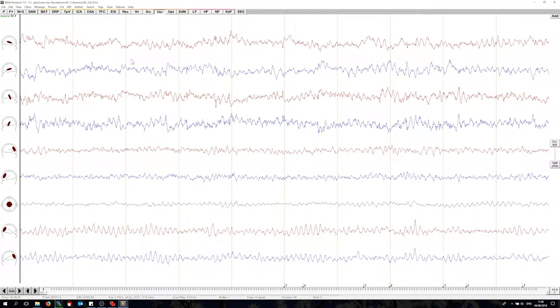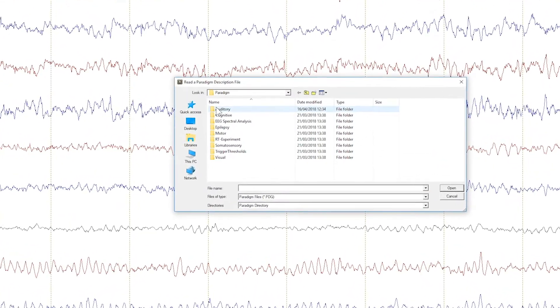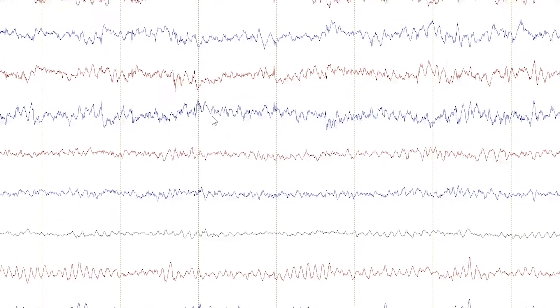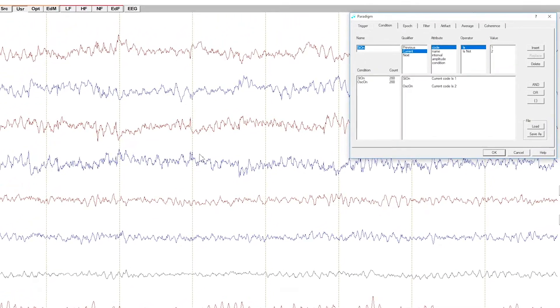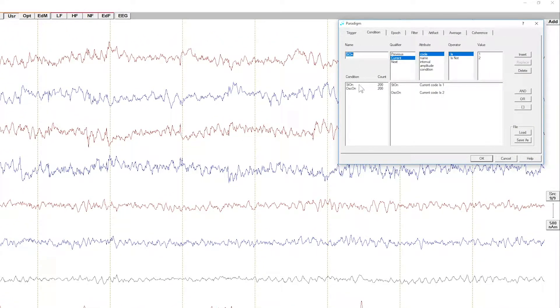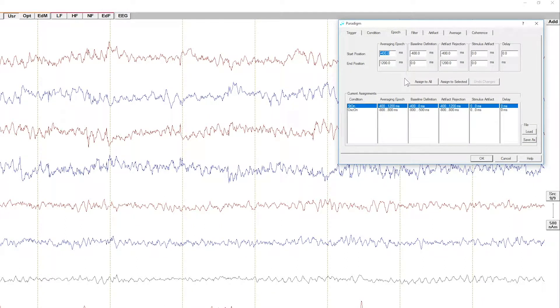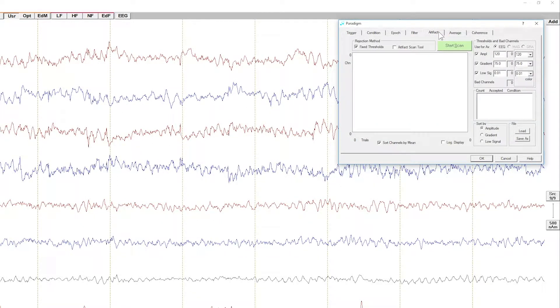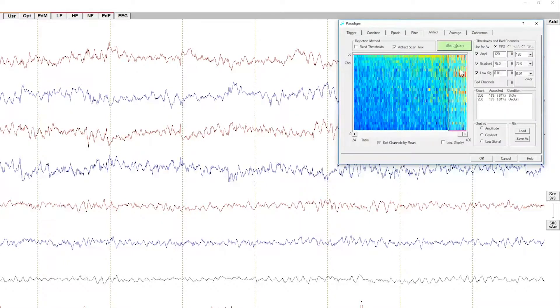Now as a second step I'm going to define the paradigm for this experiment. I press the ERP button and open the predefined paradigm file for this experiment. This gives me two conditions. I'm interested in the first one which marks the evoked activity. The epoch is set from minus 400 milliseconds to 1200 milliseconds after the stimulus. Let us run an artifact scan to discard epochs which carry artifacts. We will keep 82% of the epochs, which is shown here on the right.